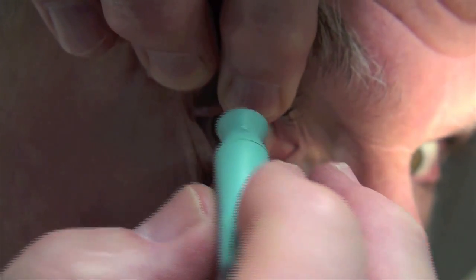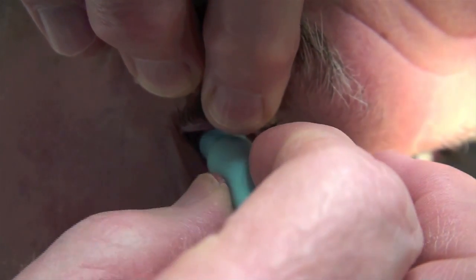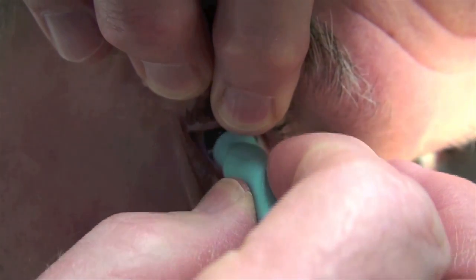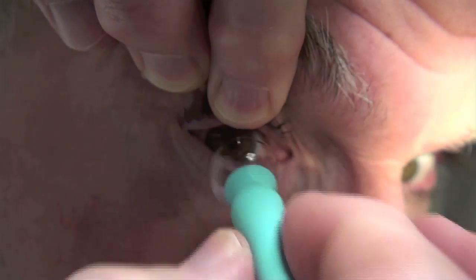I don't directly pull the suction device into the lens like I'm trying to clear a drain. I want the lens to come off the eye with as little irritation as possible. It's not always possible to avoid a little pop where we've gotten negative pressure behind the lens, but we want to really minimize that, because this is the patient's most uncomfortable moment when it's done improperly — and it's really a non-event when you do it the right way.